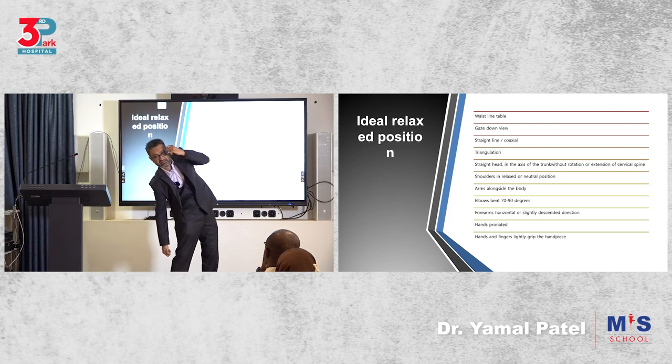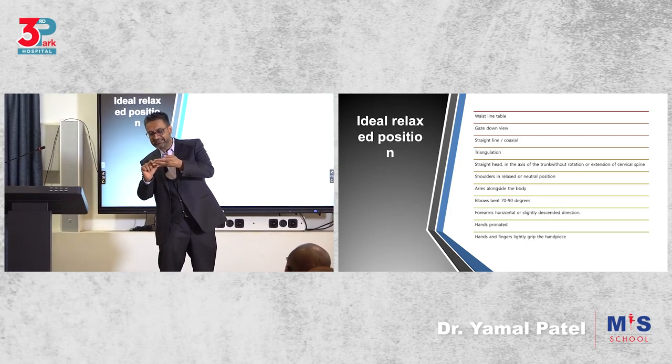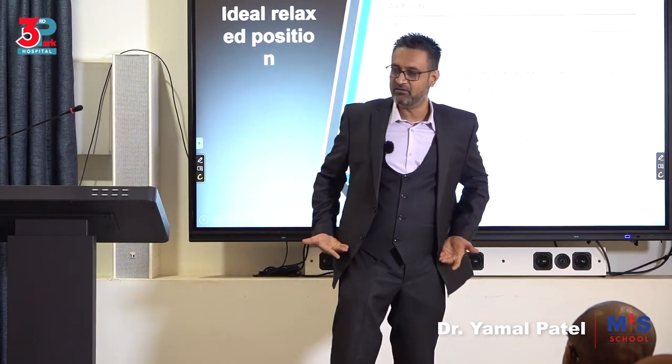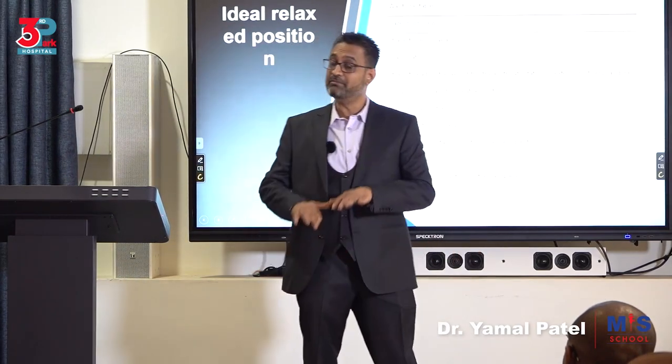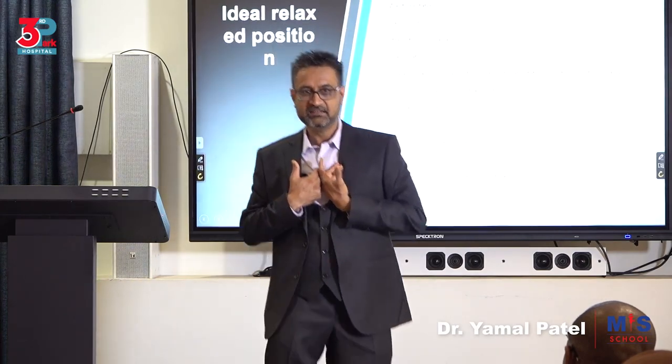So don't start measuring and then say, okay, 0.49, bring it at 98 centimeters. It's not that way, but what I meant was roughly the level of the waist or slightly below would be your table height. So what happens when I'm the surgeon and Joy, who is a very tall person there, hi Joy, yes, is my assistant.